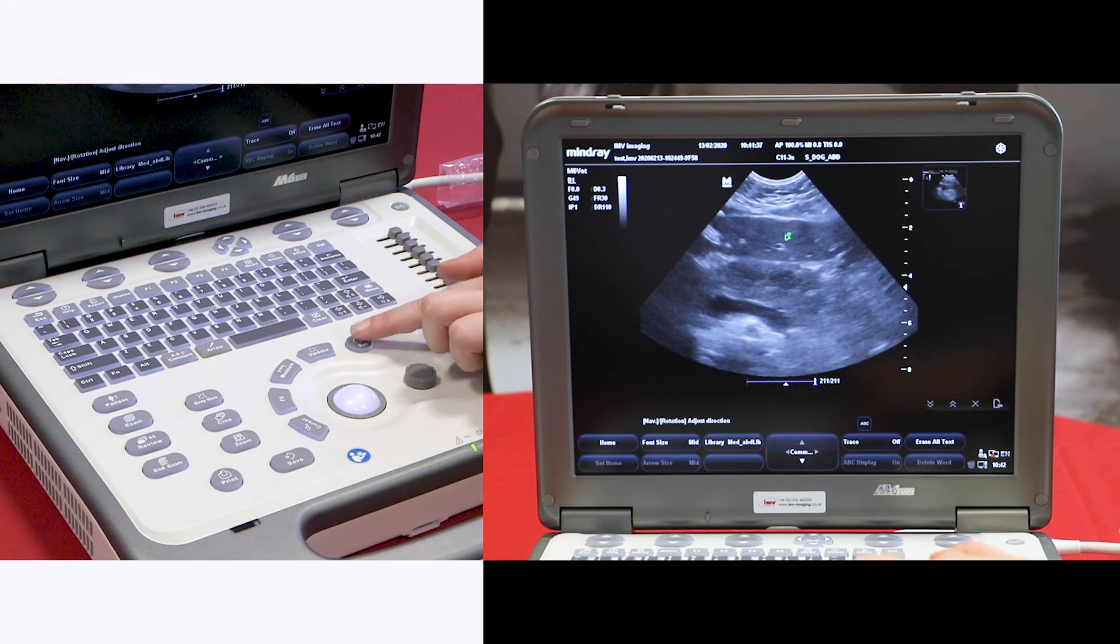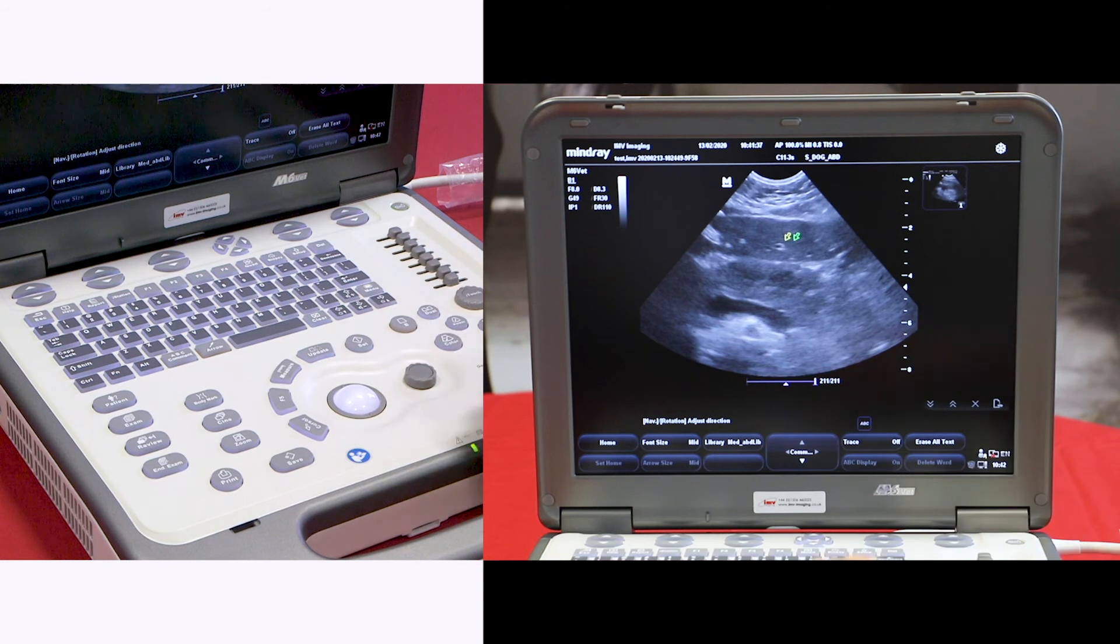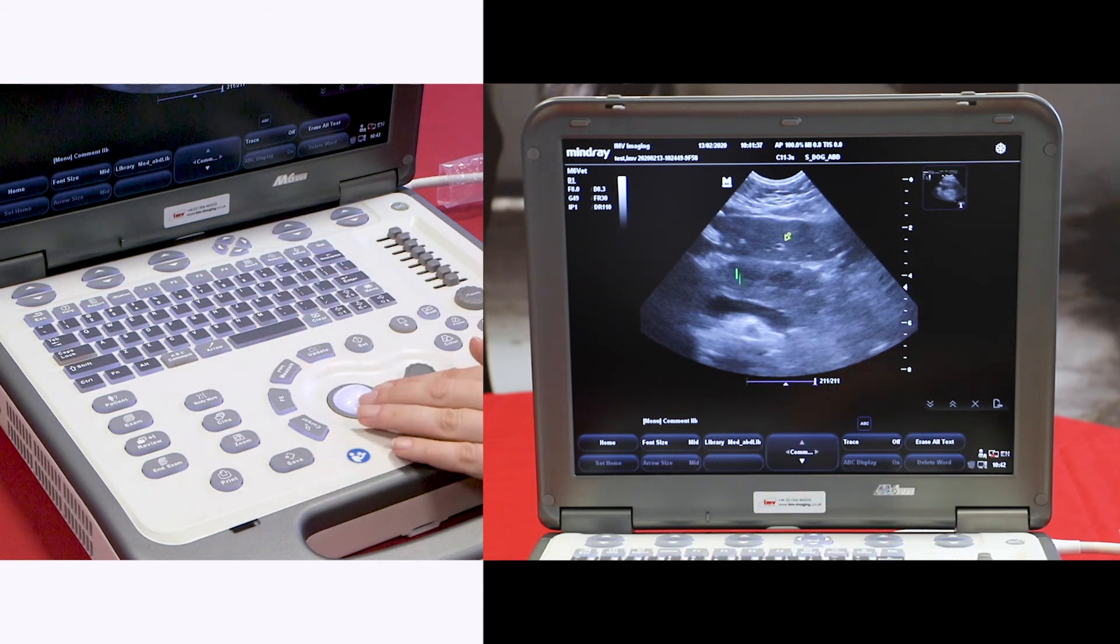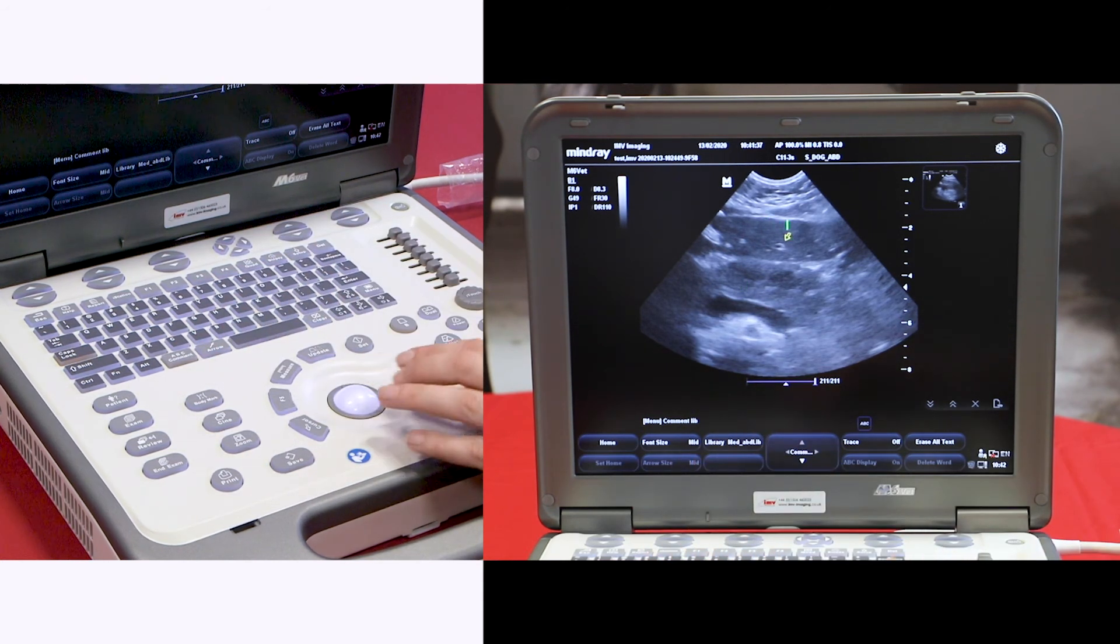When it's in the appropriate place, press set.